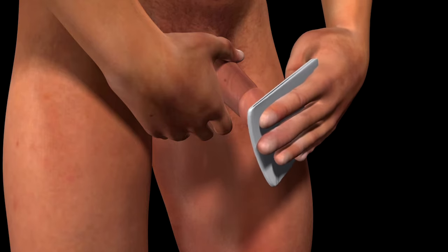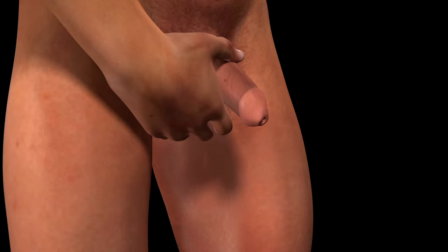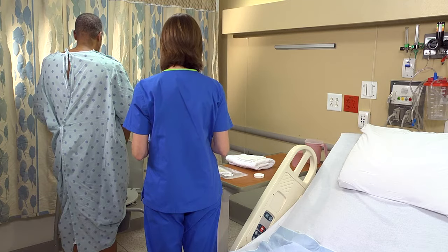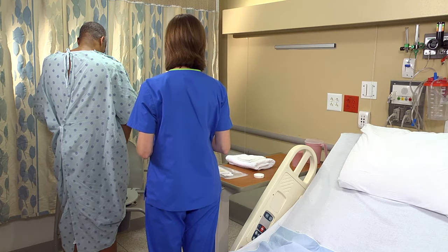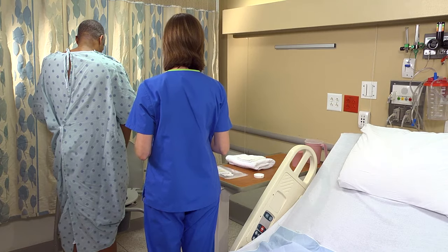If the patient is uncircumcised, ask him to retract the foreskin so that the meatus can be cleaned effectively. Keep the foreskin retracted as he voids and return it to its natural position when he's finished. If your agency's procedure calls for it, rinse the area with sterile water and dry it with cotton balls or gauze pads.